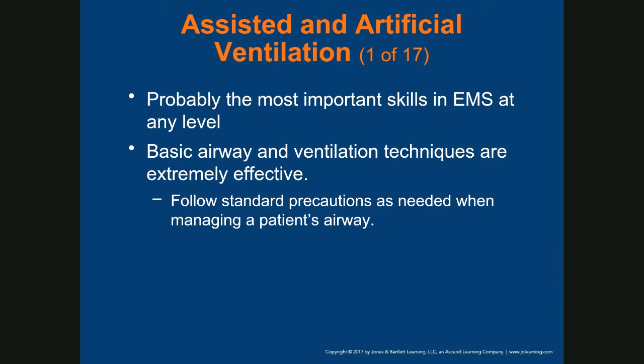Follow standard precautions as needed when managing a patient's airway. Now, the difference between artificial ventilation and assisted ventilation is: you provide artificial ventilation using your BVM or pocket mask for a patient that has no ventilation, right?